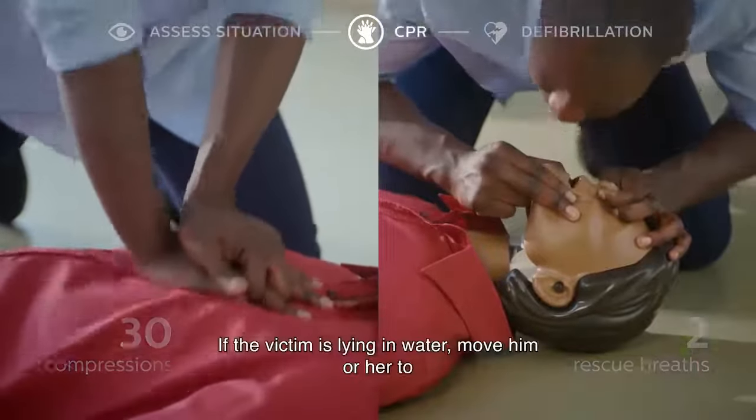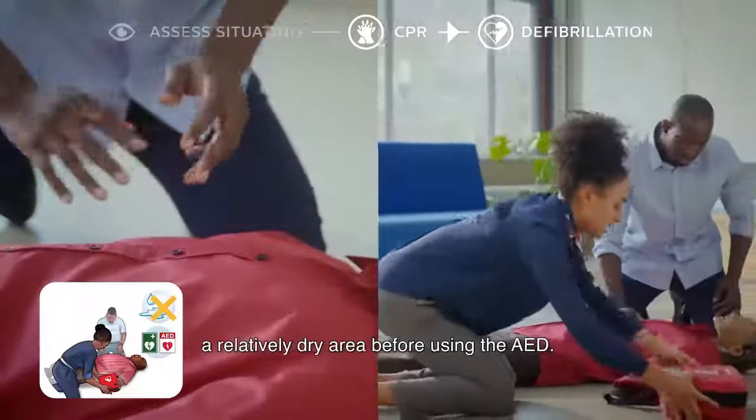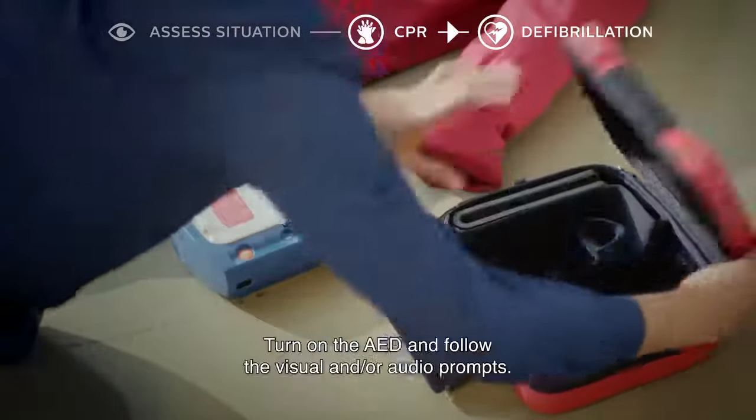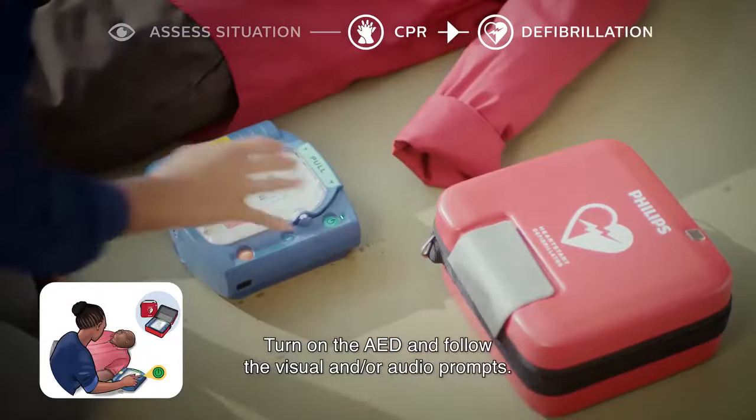If the victim is lying in water, move him or her to a relatively dry area before using the AED. Open the AED box. Turn on the AED and follow the visual and/or audio prompts.